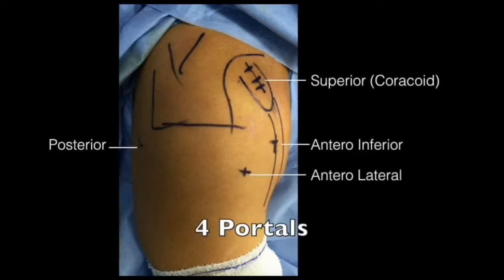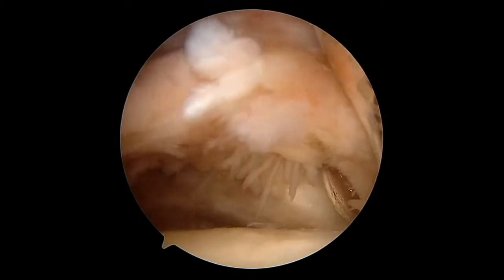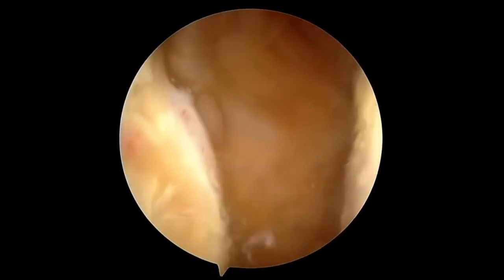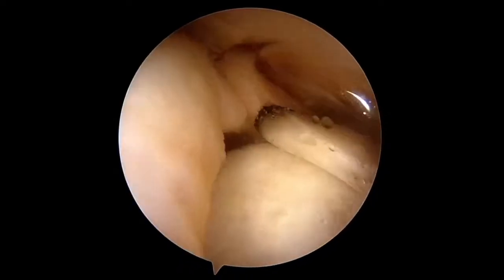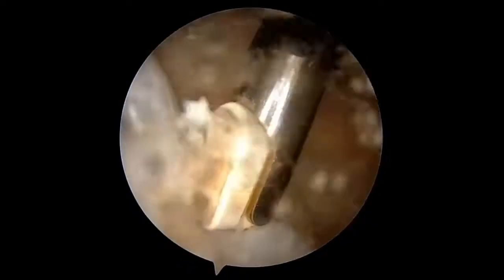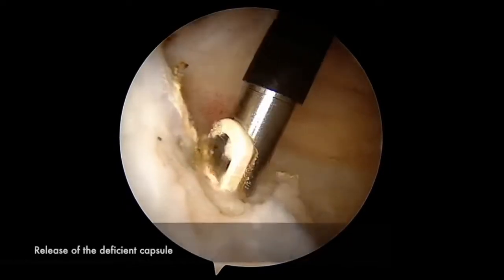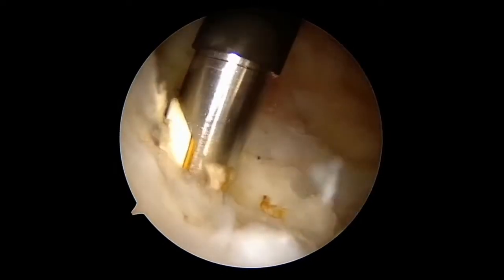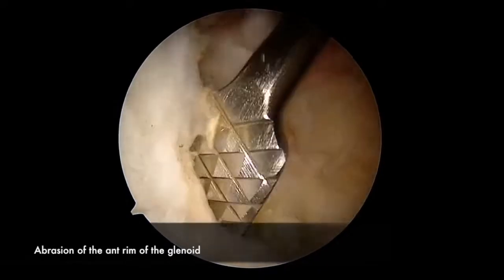Viewing from posteriorly, a diagnostic arthroscopy is performed. Along the anteroinferior aspect of the glenoid, the deficient capsulolabral complex can be identified. A radiofrequency ablation probe is inserted and the scarred capsule and labrum are removed from the anterior aspect of the glenoid neck. Abrasion is then performed of the anterior glenoid rim to facilitate healing.